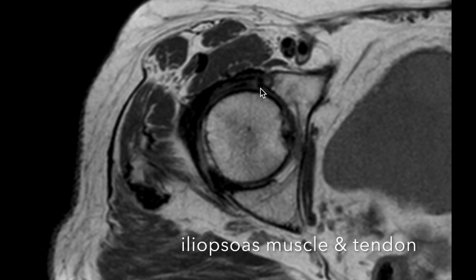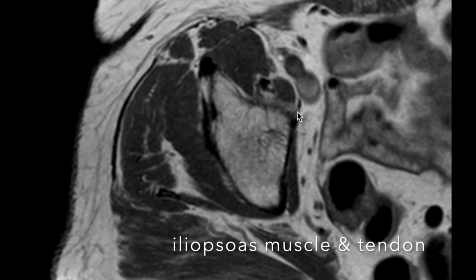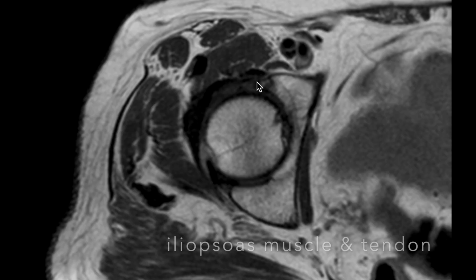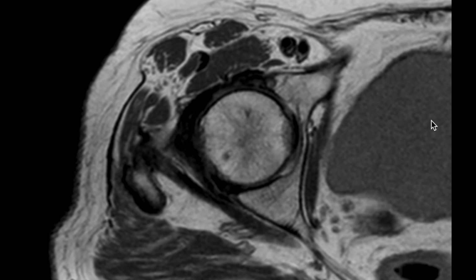I had some labels here that are not apparently showing on this screen, but this one is going to be the iliopsoas tendon. And the reason I wanted to point this out, there's a syndrome called the snapping hip syndrome, and I don't think it's necessarily well understood in terms of the exact mechanism.